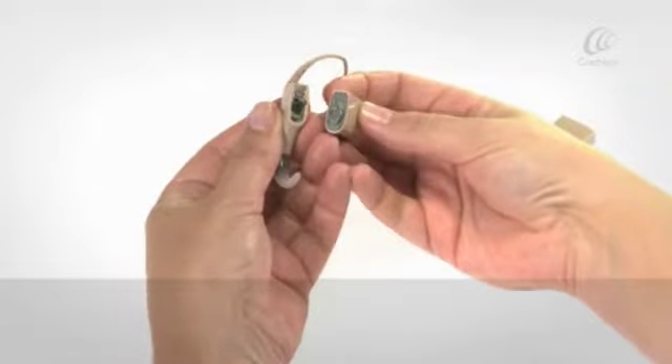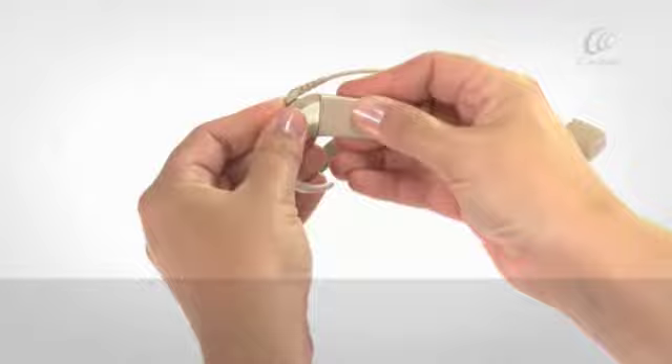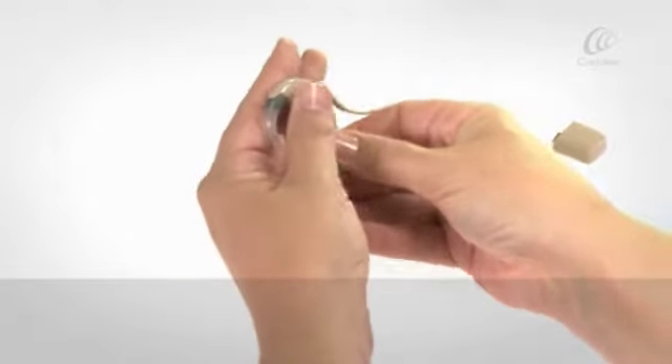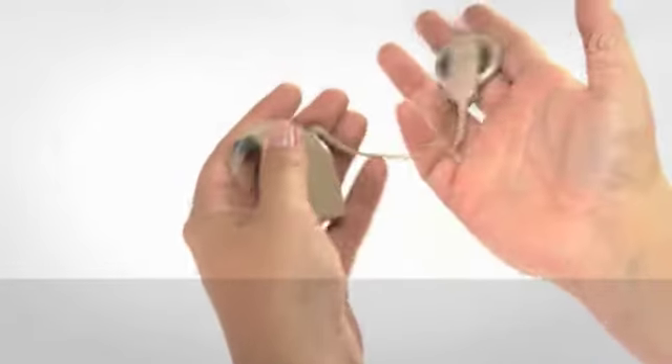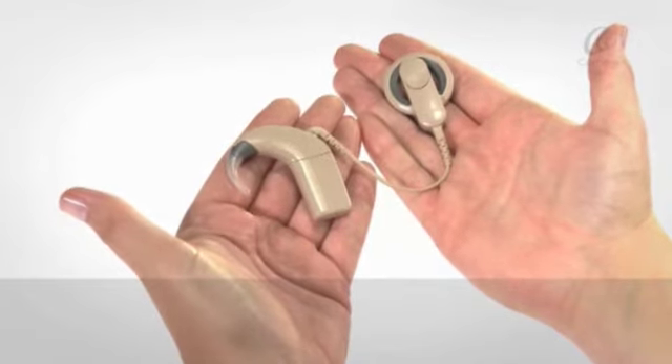Align the battery module to the processor socket to fit the parts together. Twist the battery module to attach the parts. The processor will turn on automatically.